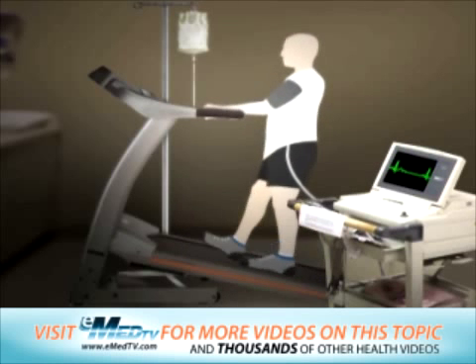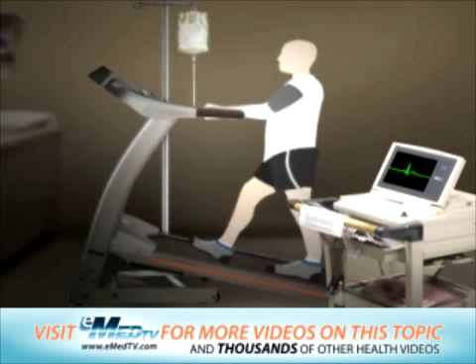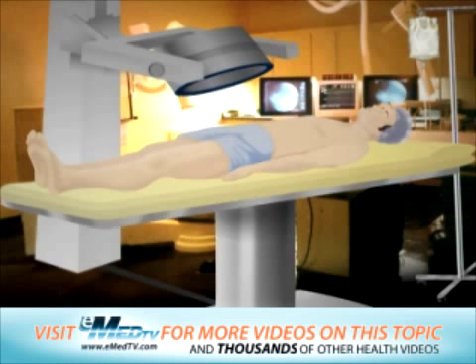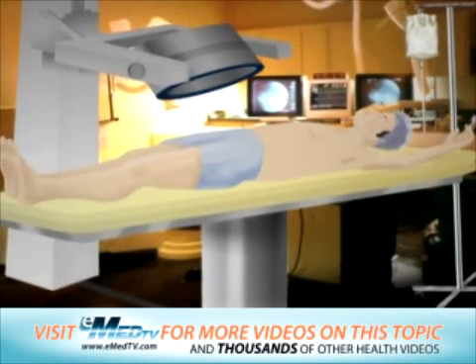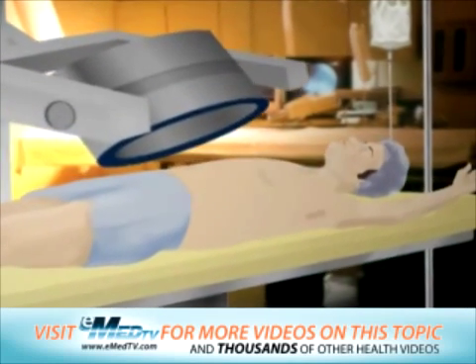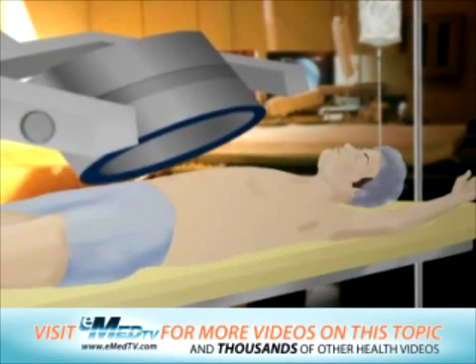The exercise part of the test usually lasts a total of 8 to 12 minutes. When you are finished exercising, you will be asked to lie down on the narrow imaging table and hold your left arm above your head. A large imaging camera will be brought close to your chest for a series of scans or pictures.